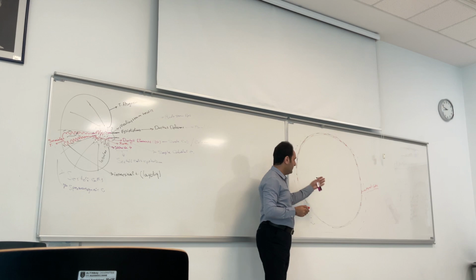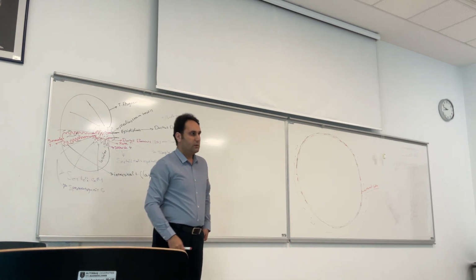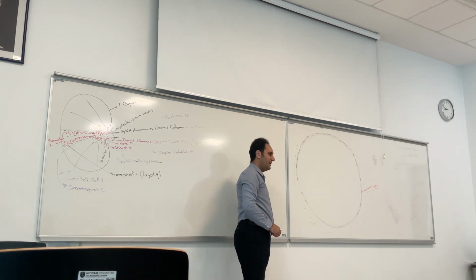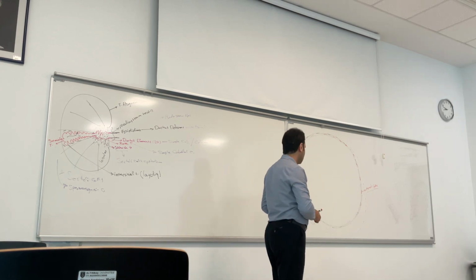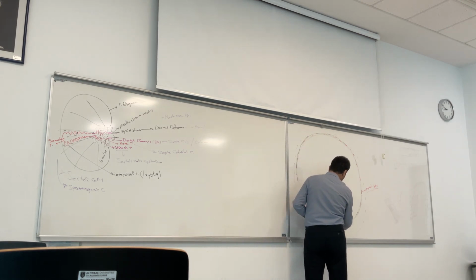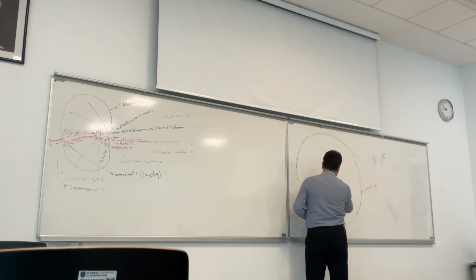When we look at the inner side of the seminiferous tubule, we can identify longitudinal or columnar cells, long cells which have a basement part in this area and continue toward the luminal side.